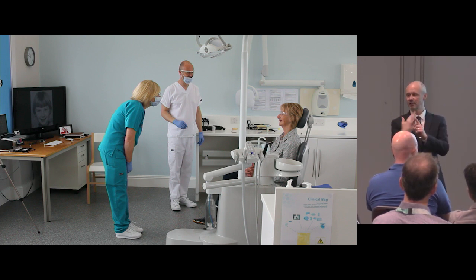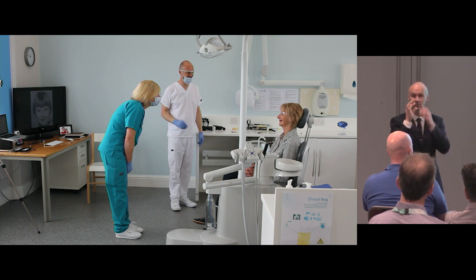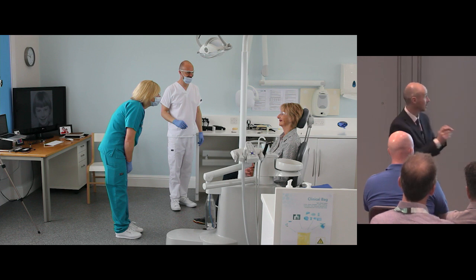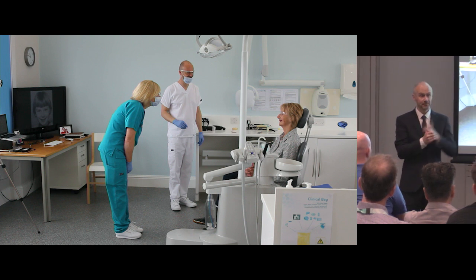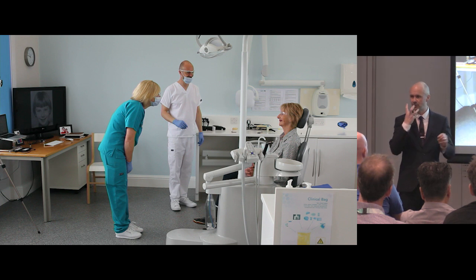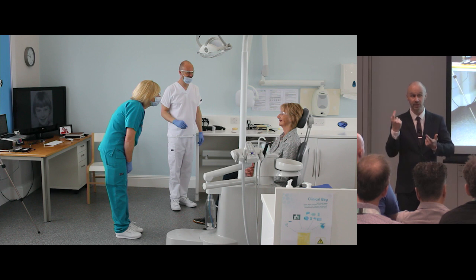Number 2 is incisal plane. Number 1 is lip support. I actually amalgamate lip support and incisal plane together. I do those at the same time. So I'll quickly trim it to approximately the right length incisally, and then I'll work on the lip support. But seriously, if you have an assistant working with you, like Claire, who's worked with me for 12 years, she's got a great eye for knowing when the patient's starting to look right as well. And it's a total constant dialogue between Claire and me at this point.